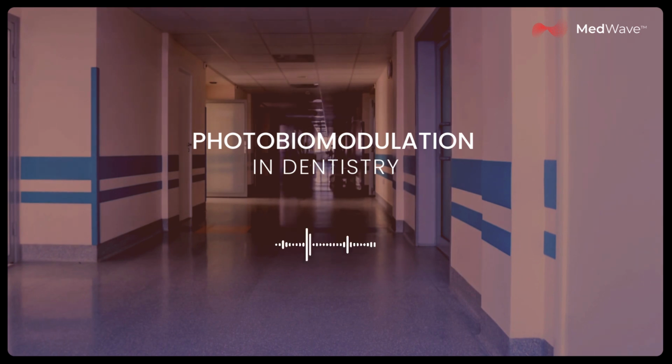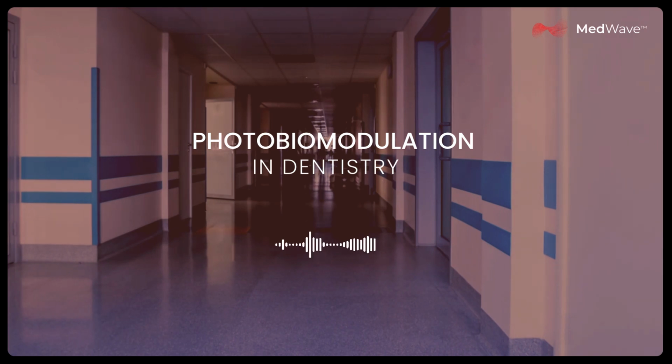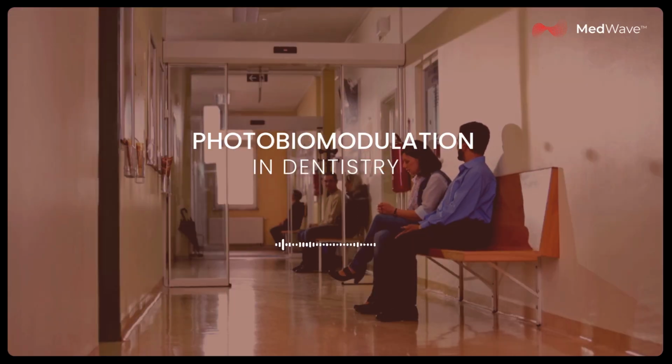Yeah, there are a couple of key reasons for that. Firstly, these wavelengths fall within what's called the optical window for biological tissues. That means they can penetrate deeper into the body, reaching those targeted cells more effectively. Got it. And secondly, a growing body of research has shown these specific wavelengths to be particularly effective in stimulating healing and reducing inflammation. So it's a combination of good penetration and proven results. It sounds like they're really strategically aligning their technology with the latest scientific findings. Absolutely. They're not just throwing darts at a board here. They're making informed decisions based on the evidence.